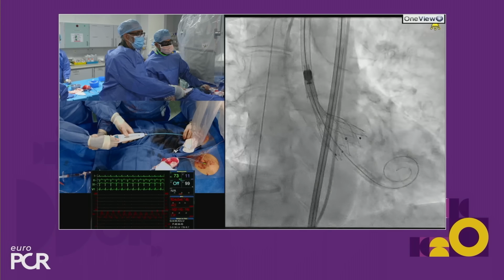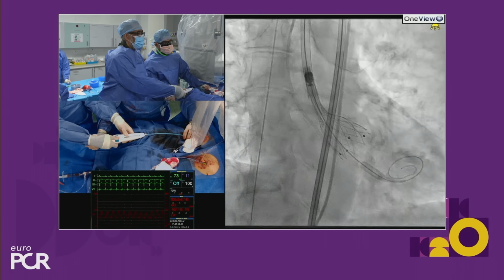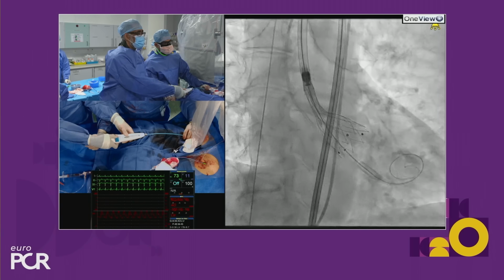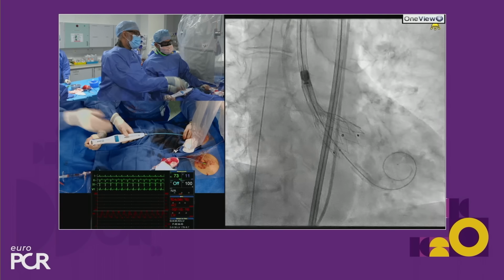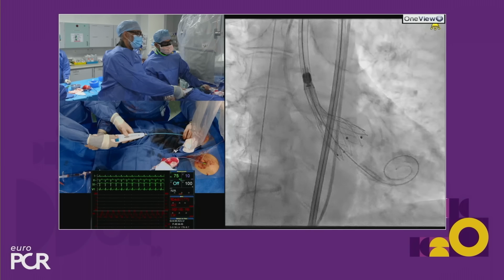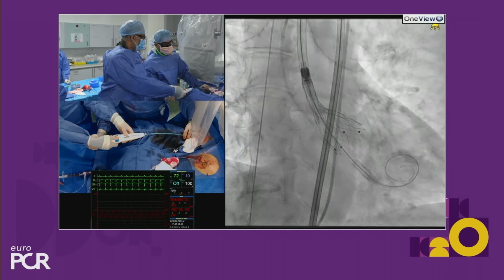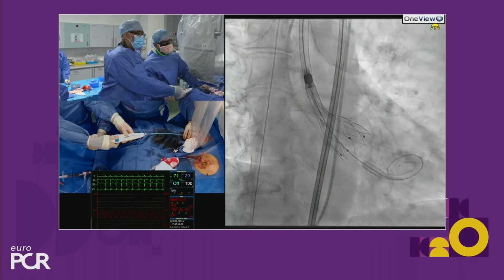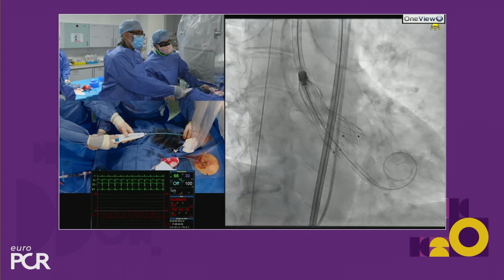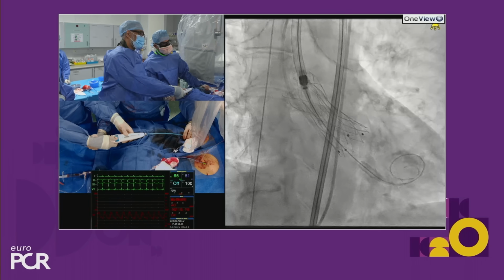And we're keeping an eye, I don't think it's going to move, but keeping an eye. And then we'll repeat our pictures before we pull the pigtail back. Now, some people would pull the pigtail back now. I don't think there's any danger with that pigtail particularly. I think I wouldn't. That's not our standard. We don't normally do it. And so I think we'll just stick with our normal pathway. And here, I mean, I'm very neutral. Yeah. So I'm deliberately doing it nice and slowly.